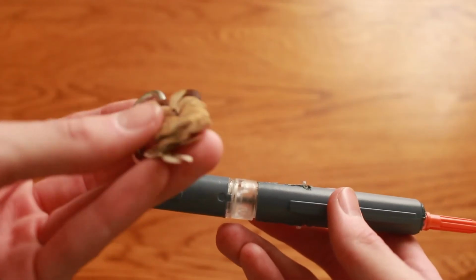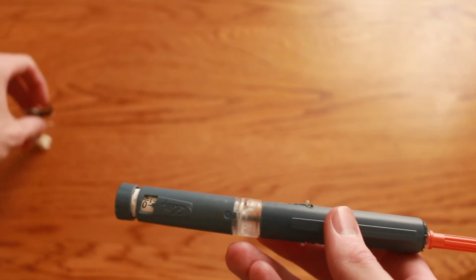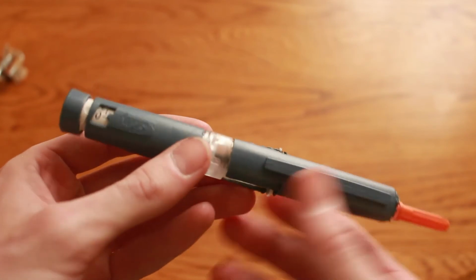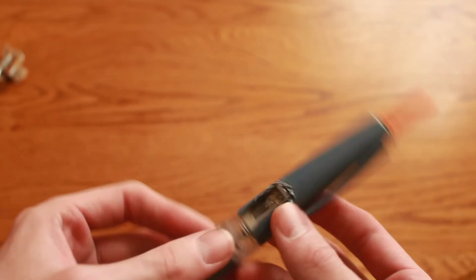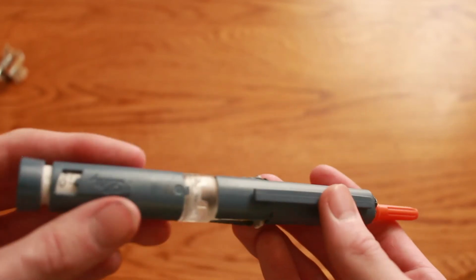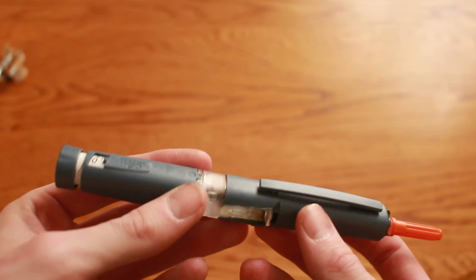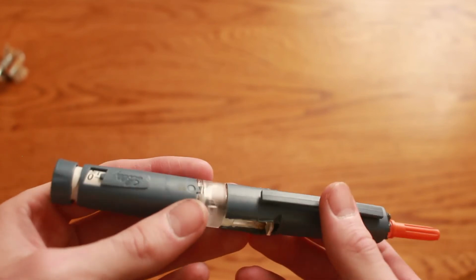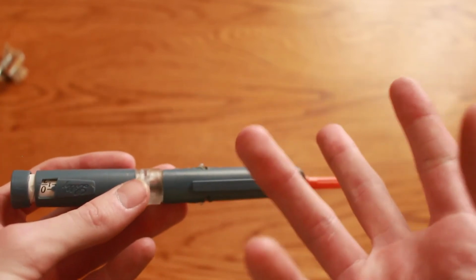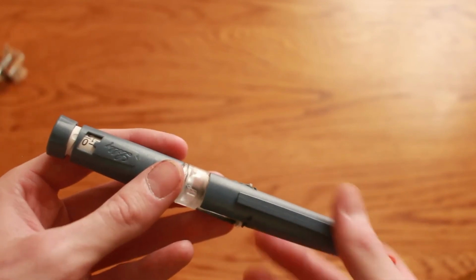Now, unlike this invention I've made that sort of requires a laser cutter to really get these precise cuts, you can actually use your own tools at home to do this. All you really need is a strong pair of scissors to cut through the plastic over in the clear part and also cut the holes here, and also cut a hole in the top for the syringe to stick through. It is possible to do it with scissors, but I used a very powerful wood burning tool called the Colwood Detailer. If you do that, be sure to use protection, goggles, mask, gloves, because there are plastic fumes. But if you just start to use scissors, you can probably pull this off too.